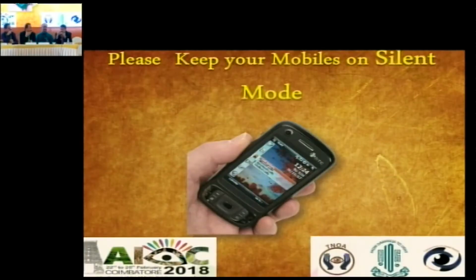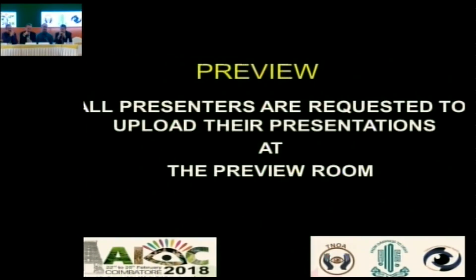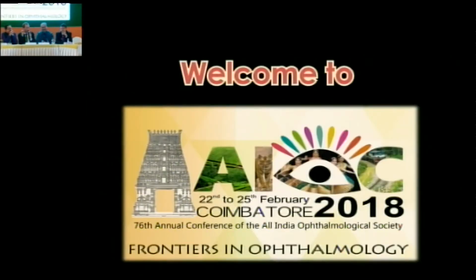But I've tried in a couple of cases, and we have our Infinity, so we don't have the 15-degree phaco tip. When I spoke about it to others, it always gives an unpredictable result. I think in India, Dr. Mohan Rajan is the only person who is doing phacorexis and nobody else. No, actually, this concept was very nice, to do the phacorexis, but I tried in some of my cases. In one of the cases, I tried to do it, and it captured everything and pulled out the capsule.